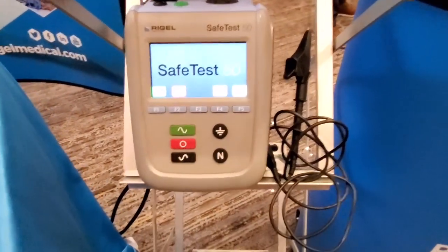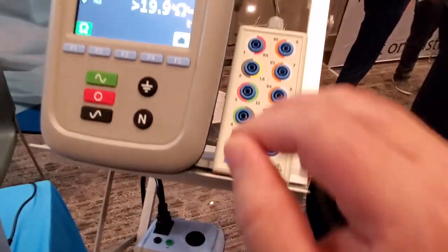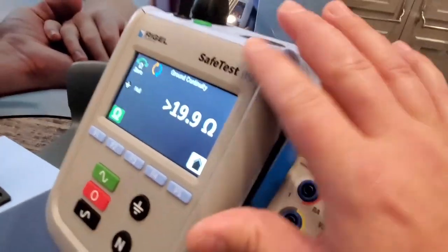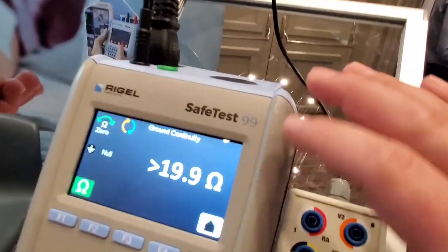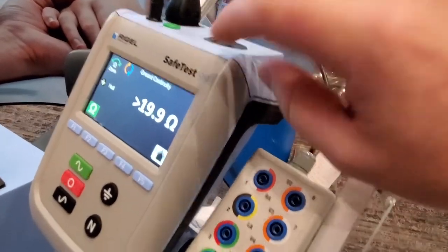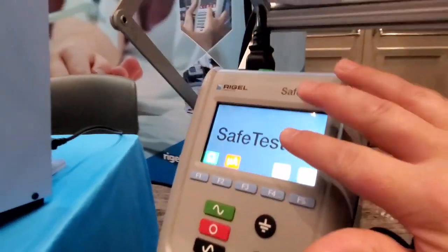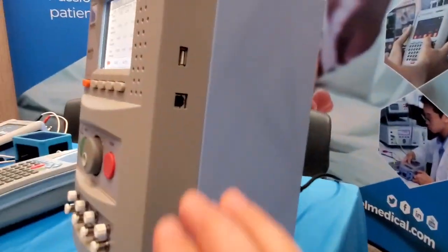First off, let's check out these electrical safety analyzers. There's two of them: the SafeTest 50 and the SafeTest 99. You can see the port for plugging in is on the top. Look at that big beautiful screen, physical buttons right on the front — it's beautiful, very intuitive. I feel like I could give these to anybody, send them out in the field, and they'd know what to do. There's an attached option for the 99 series — you've got your EKG so you can do EKG traces and simulations.